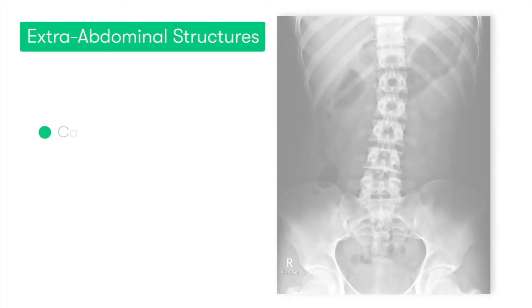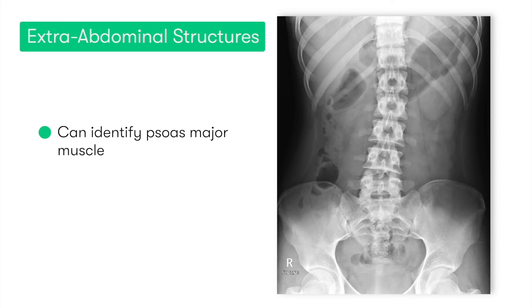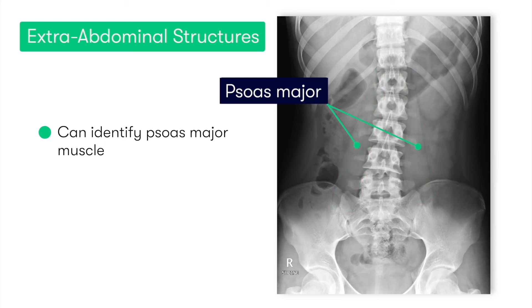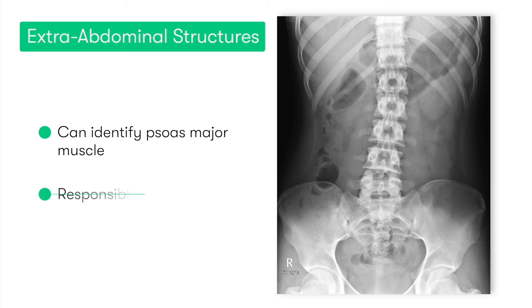The main muscle that we can aim to identify in our abdominal x-rays is the psoas major muscle, which is a posterior abdominal muscle extending from the lumbar vertebrae down to the lesser trochanter of the femur, and is responsible for flexion of the hip.